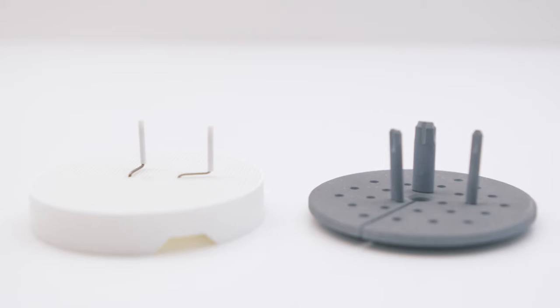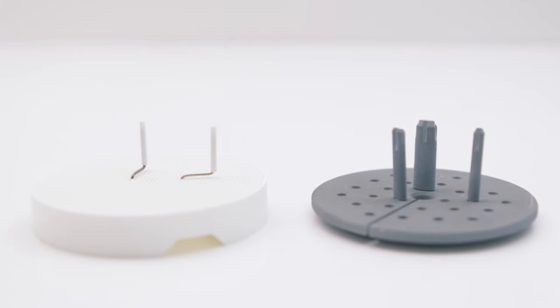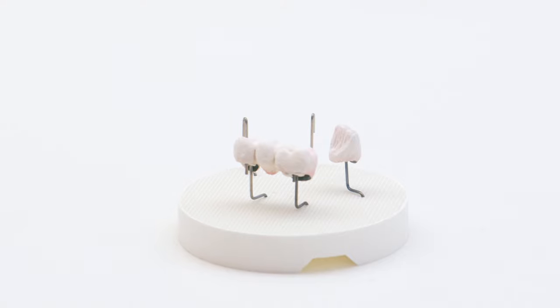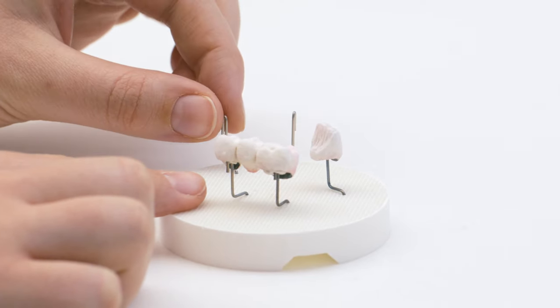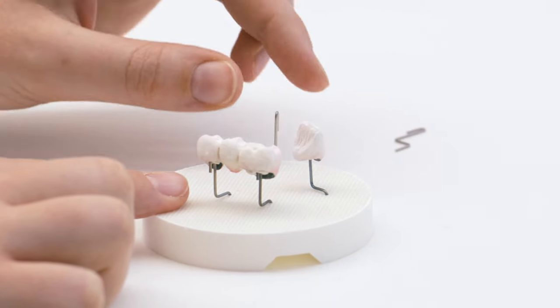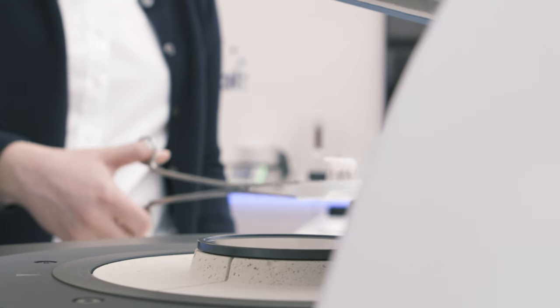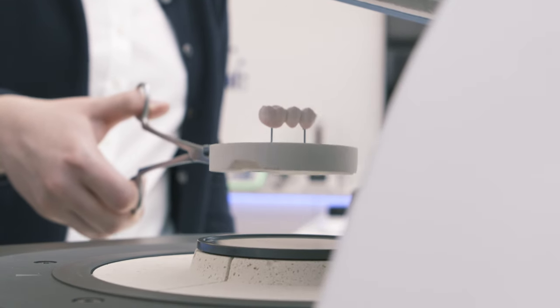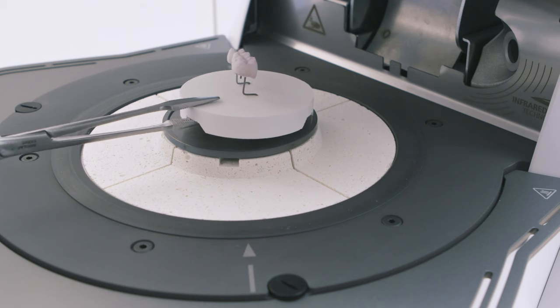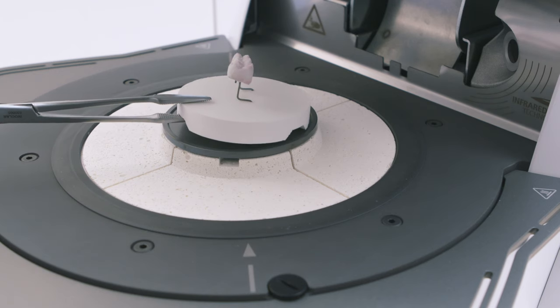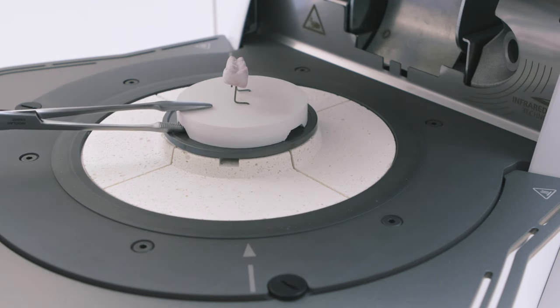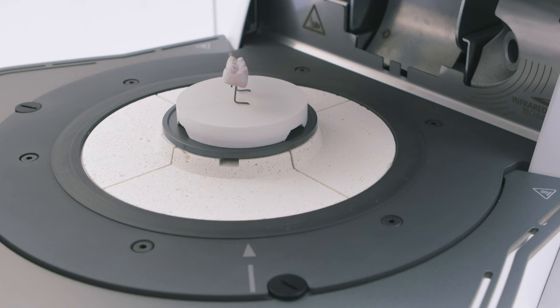Only use the Programat firing trays recommended by Ivoclar for the respective material. Unused firing pins or fan pins should be removed from the firing tray if possible. Position the objects in such a way that the infrared camera has a wide view of the objects. Use the markings on the frame plate as a reference.